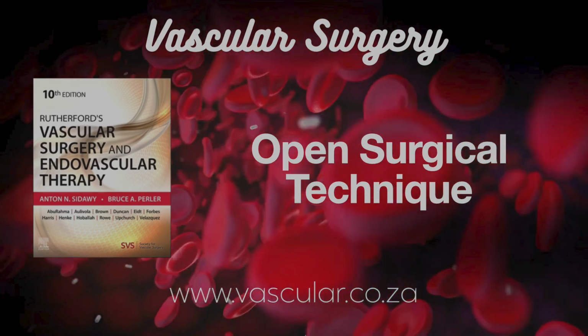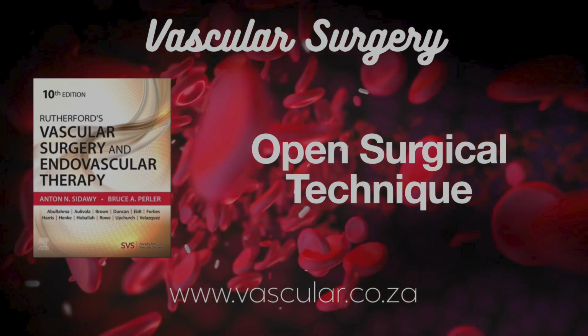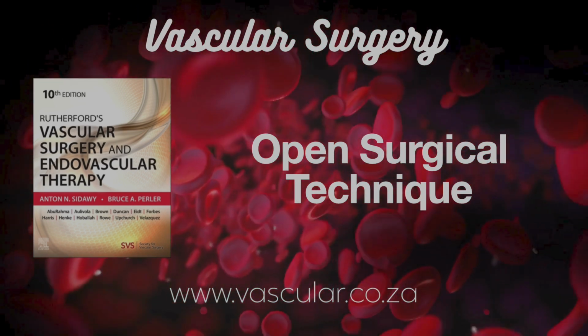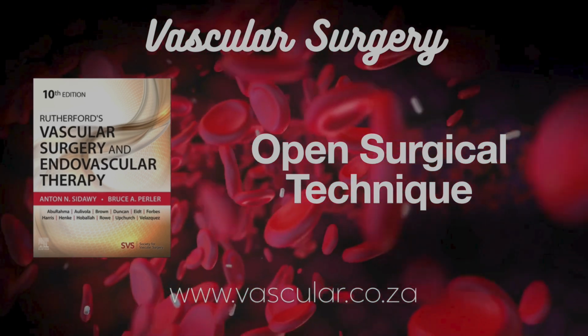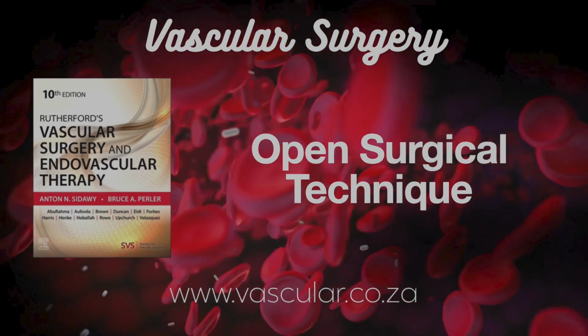Getting a good view must be critical. Retractors. Exactly. Self-retaining retractors are often preferred. Why self-retaining? They provide stable, consistent retraction without someone having to constantly hold them and apply pressure. It frees up hands and avoids excessive force. Makes sense. Any specific examples?